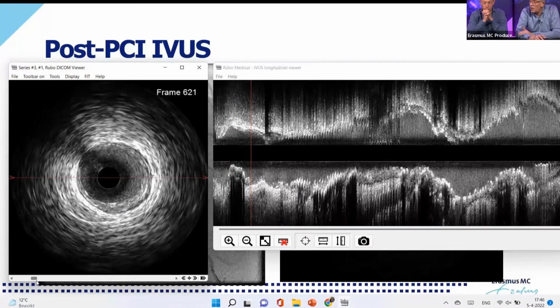But the 60 megahertz of ACIST is a broadband, because indeed, otherwise you would only see the near field and you couldn't even reach the outside of the vessel. So it's not only 60 megahertz that is doing the trick, but also lower frequencies.